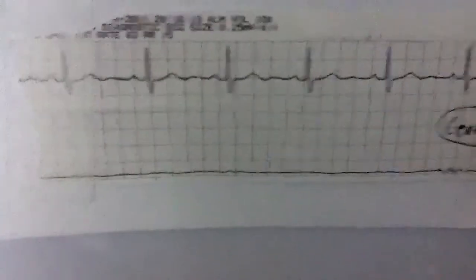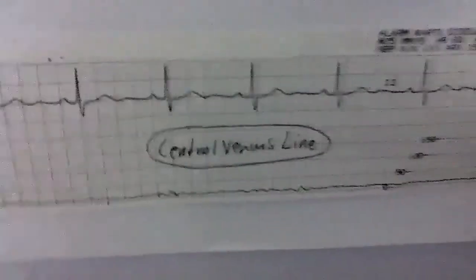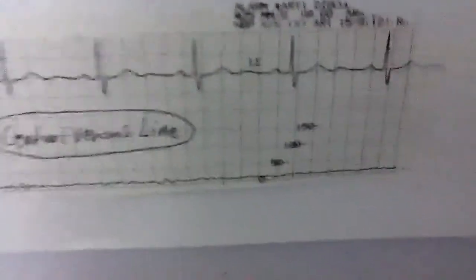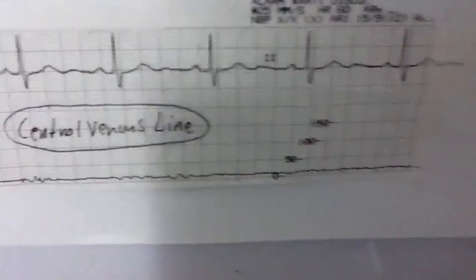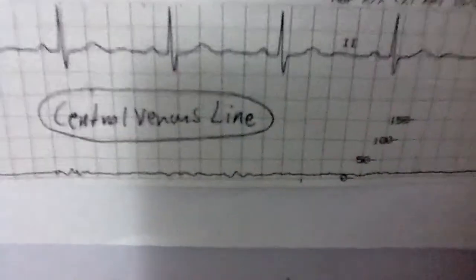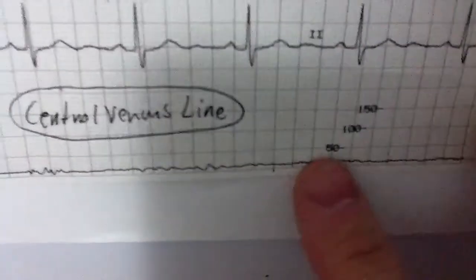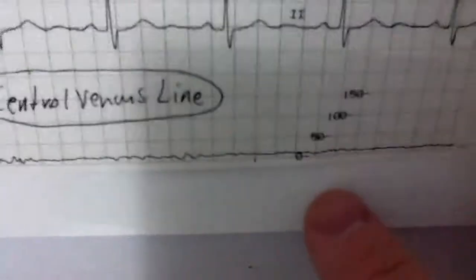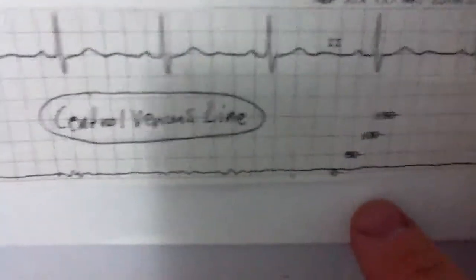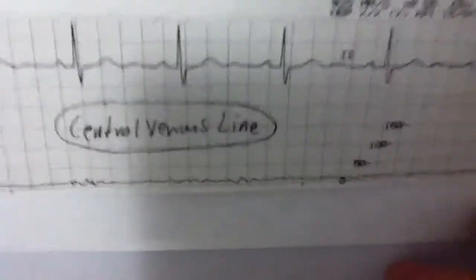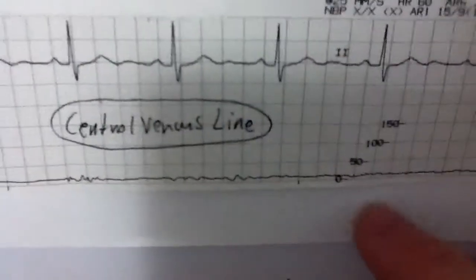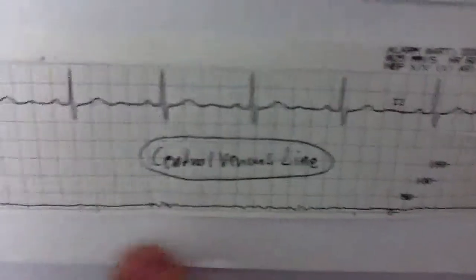Moving on down here, I actually have an example of a central line. Now, whoever is monitoring this patient set their scale up kind of interesting. If you see the scale here, it goes from 0 to 150. And if a normal CVP is anywhere from 2 to 6 millimeters of mercury, obviously this is going to create a very, very small tracing.